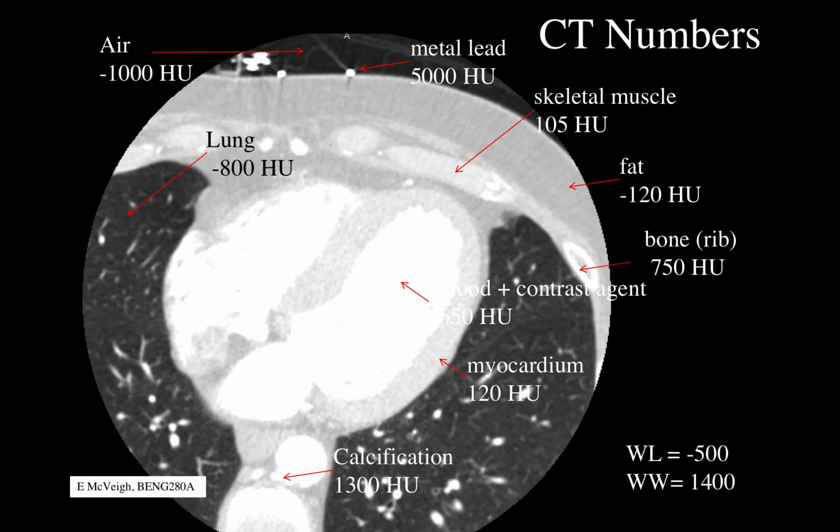Anything else down there? Not much? Sorry, I just have a quick question. So how would you explain the lung again, like the negative sign in 800? Yeah. So air is set by that calibration to minus 1,000, and the lung then would be negative 800 with respect to air, you mean? With respect to air and what the water calibration was that day.